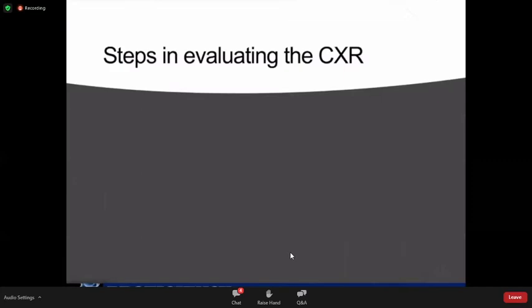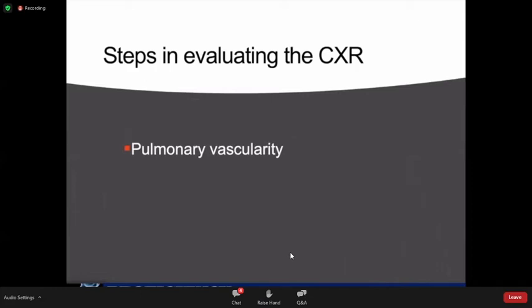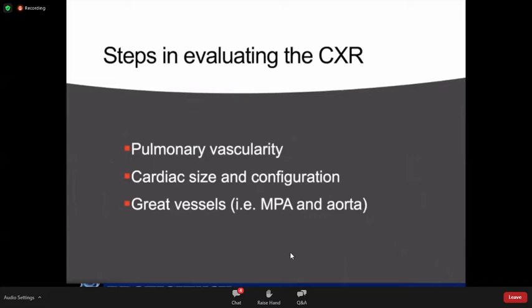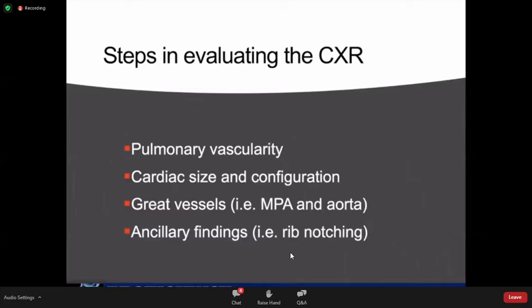Here are the steps in evaluating your chest X-ray. You can go from inside out, or outside in — the key is to be systematic so you do not miss any important details. I usually look at pulmonary vascularity first, as from here I can already deduce whether I am dealing with acquired or congenital heart disease. After that, I look at cardiac size and configuration, then the great vessels — the main pulmonary artery and the aorta — and lastly, other findings.